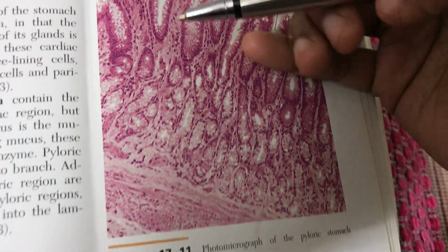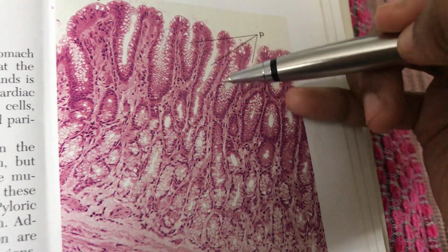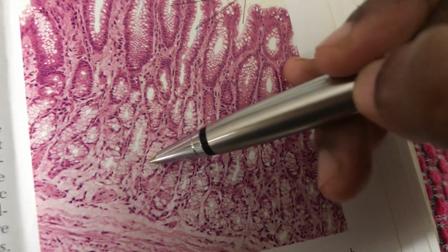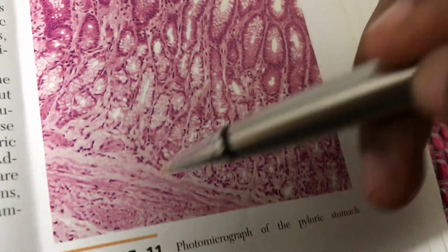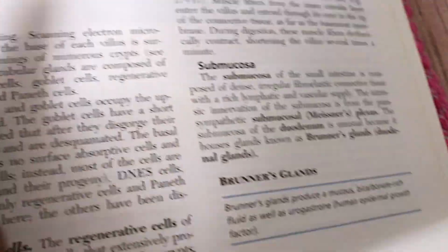Next layer, if you see, pylorus. See, look at the pits. It's very deep. The pits are very deep, and you have the pyloric glands here, and the rest of the layers are the same. Mucous neck cells are more in the pylorus.